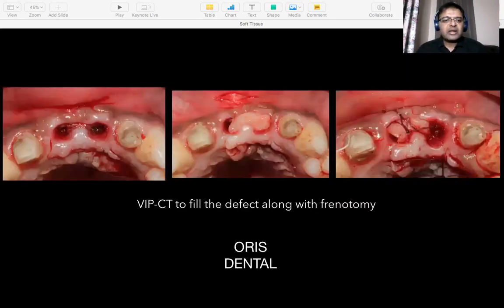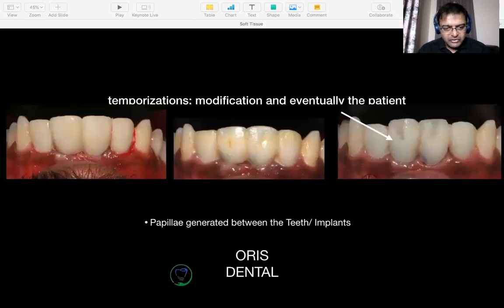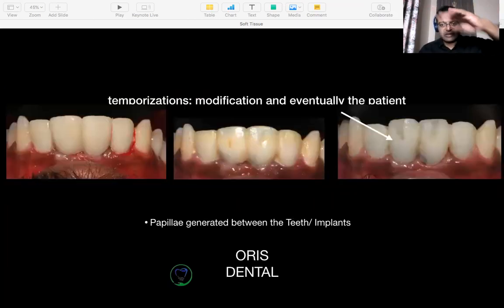So what we do then is a vascularized interpositional connective tissue graft. Go to the palate, make an incision first on the palate, remove the epithelium, separate out the epithelium, take only the connective tissue and roll it. So the connective tissue now rolls between where the potential incisive papilla is and closed up. The healing abutments go back. So now I have generated a surgical papilla. You can see here, this is on the day of suturing. 4 weeks later, I have a papilla; the depression, the ditch you have seen, that's gone.